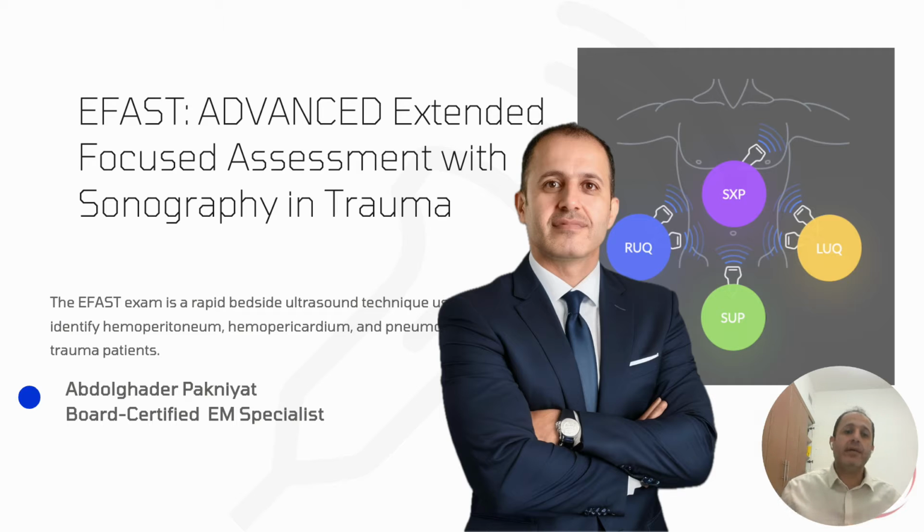Another one is the brightness, which we call gain. So how bright the image is. If it is too dark, we should increase the gain, meaning receiving more echoes, more sound from the organs, from the mediums, and we can visualize pathologic things and the normal findings much better, and we can differentiate the objects from each other. So based on the brightness, you can increase and decrease the gain.